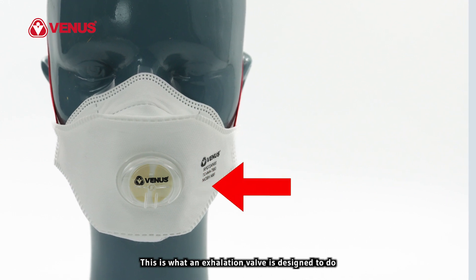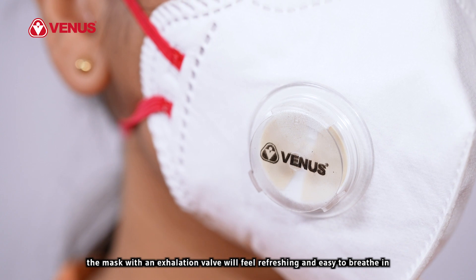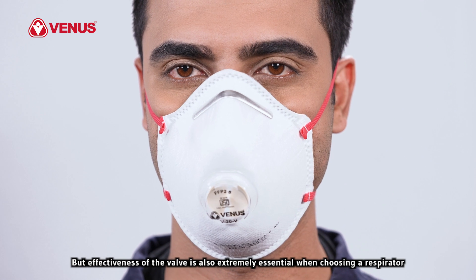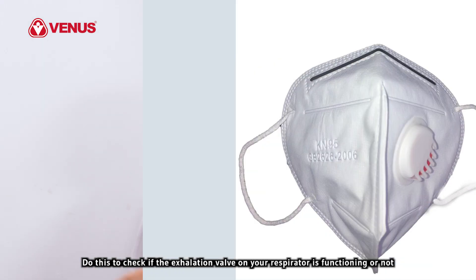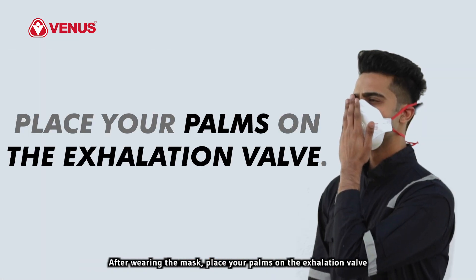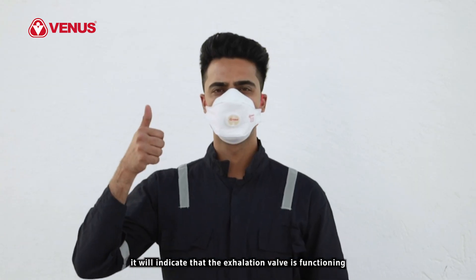This is what an exhalation valve is designed to do — remove the hot air that we breathe out from the mask. If you compare the difference by wearing one outdoors, the mask with an exhalation valve will feel refreshing and easy to breathe in. But effectiveness of the valve is also extremely essential when choosing a respirator. Many standard respirators with exhalation valves do not open effectively. Do this to check if the exhalation valve on your respirator is functioning: after wearing the mask, place your palms on the exhalation valve. If you feel air passing through the valve, it will indicate that the exhalation valve is functioning.